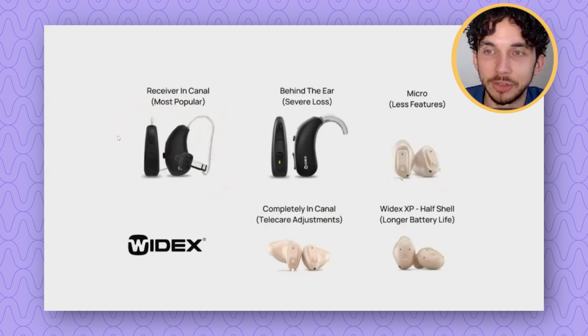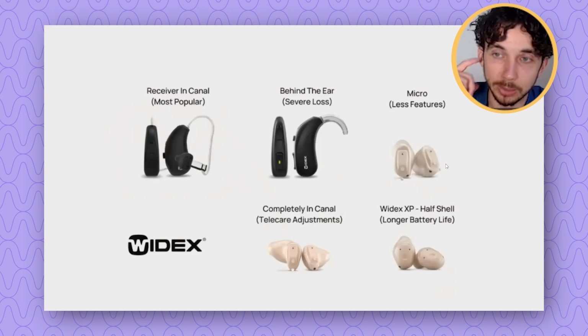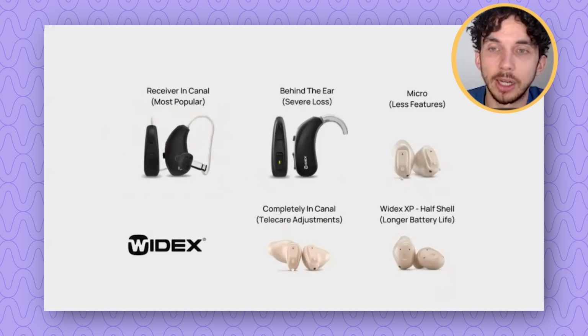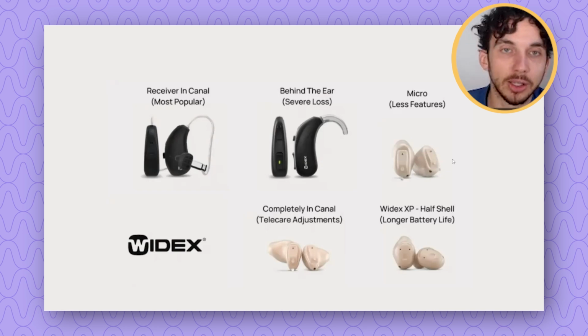About 95% of users use this device. Many people want something that's completely invisible in the ear, but what we quickly learn in the world of tinnitus is that it's a mistake to completely close your ear canal, and these devices are occluding the ear canal. So they go deep in the ear canal and they make your tinnitus louder, and they make all other sounds sort of processed. You can't hear ambient sound the same way. Therefore, these devices here are only applicable to someone who has a significant hearing loss in both ears.